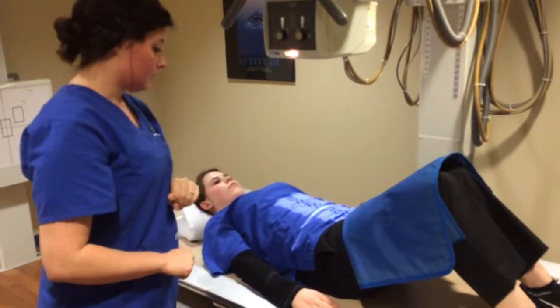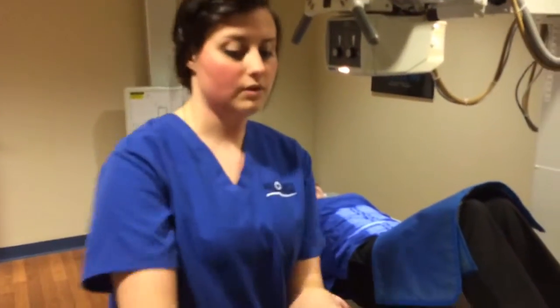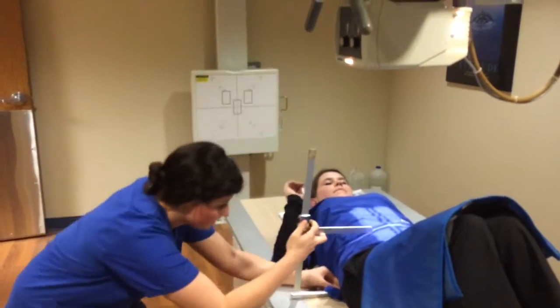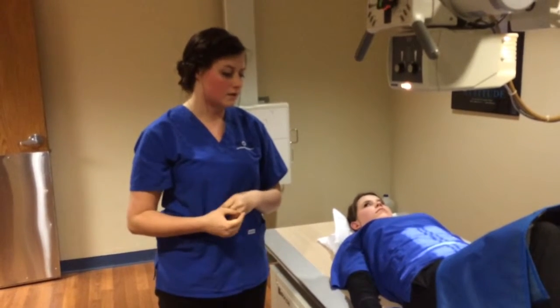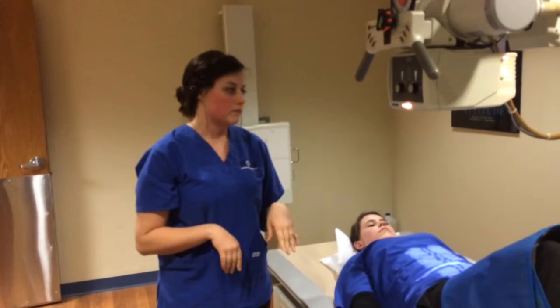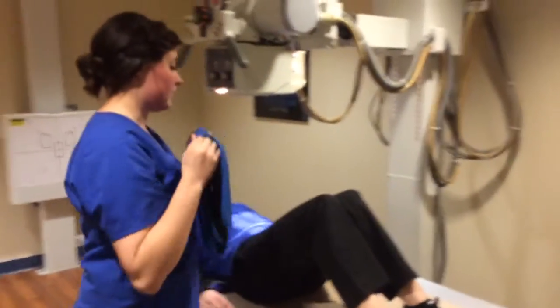which looks good. Make sure that our arms are down by her side, and next I am going to just measure in the path of the central ray, so I'll lift her arm out of the way here. And she measures about a 19, and then I'm going to step out of the room, set my exposure factors, and instruct her on some breathing instructions, which for this would be suspended expiration to move the diaphragm up and out of the way of the lumbar spine.